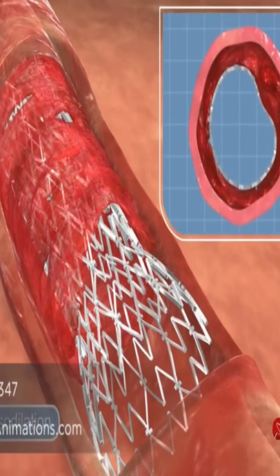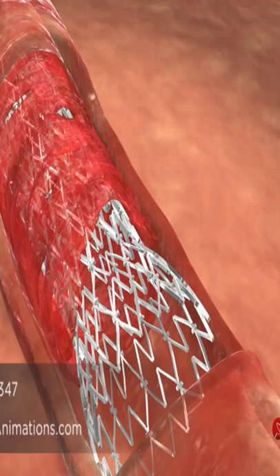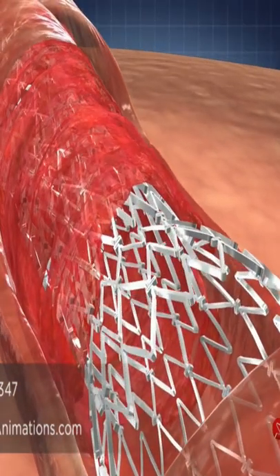As spasm is relieved, the vessel diameter increases, and the stent follows in expansion and continues its scaffolding of the artery.